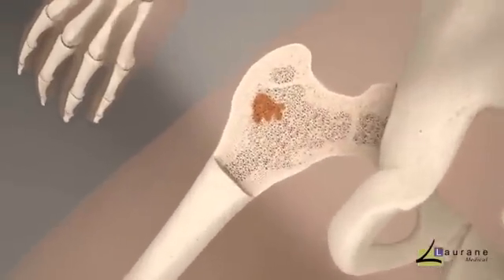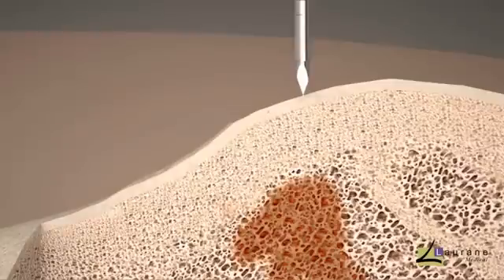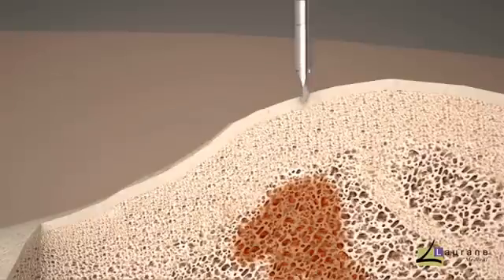After a small skin incision is made, the introducer is inserted. It is rotated counterclockwise down to the surface of the bone, thus minimizing trauma to the soft tissue. At the bone surface, the introducer is now advanced with a back-and-forth motion until the tip of the cannula is anchored in the periosteum.